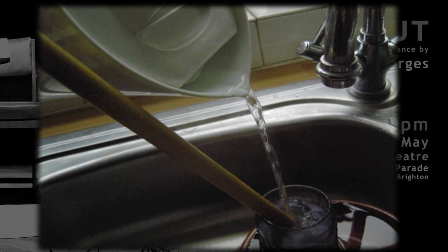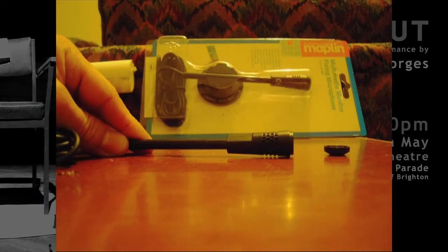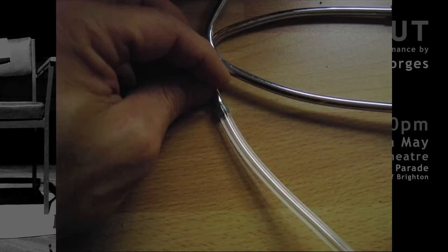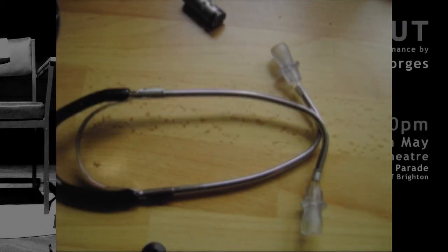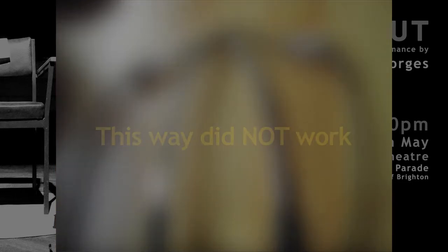I decided to put it in hot water — you can see a drumstick there doing the job — and I just had to make it bigger and bigger until it would fit. I tried a different model first, like not removing the head of the stethoscope; instead I would just connect the microphone to the end, to the part where we place in our ears, but it didn't work.